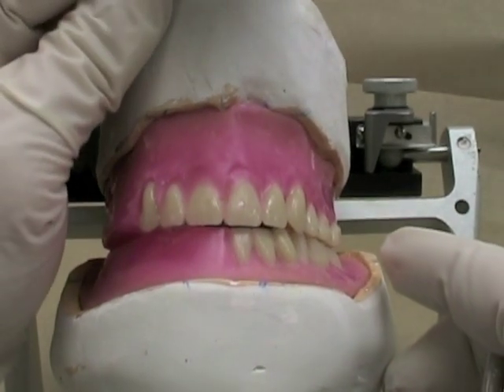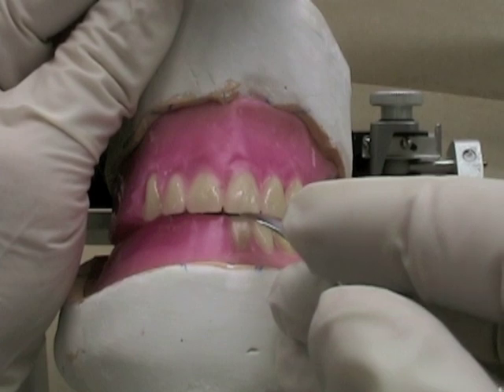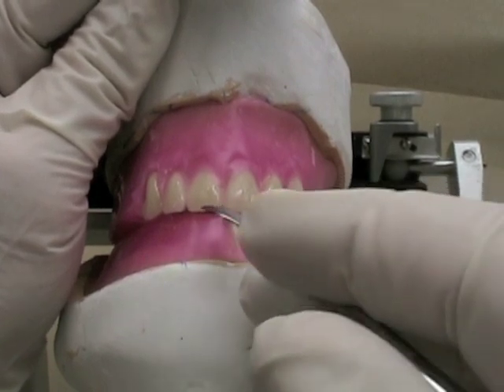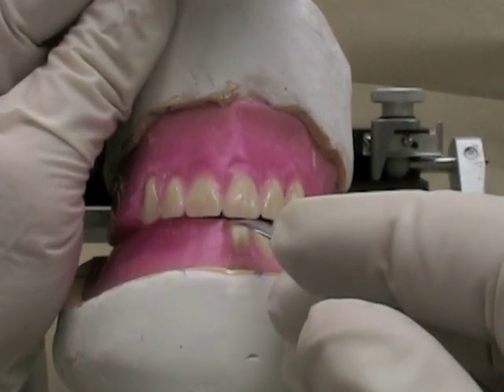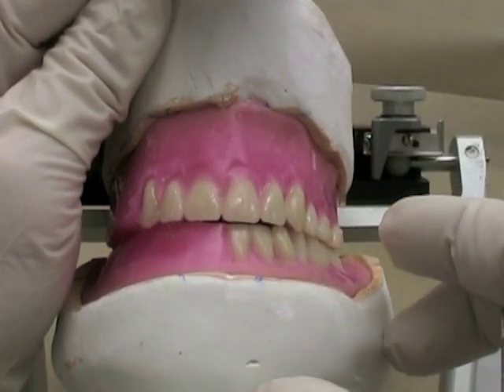The canine should be slightly lower than the incisal edge on the lateral incisor. When we look from the front, for the lingualized occlusion setup we start off with zero overbite, which often makes it a little bit easier to get balancing contacts if that's what you desire on a lingualized setup.